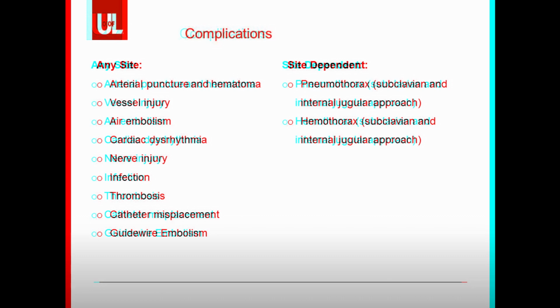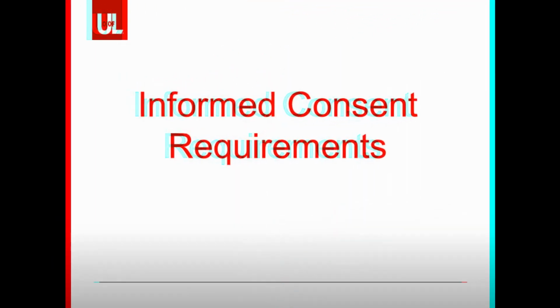Complications that are more site-dependent include pneumothorax, especially with the subclavian or internal jugular approach, and hemothorax with the subclavian or internal jugular approach. Informed consent.